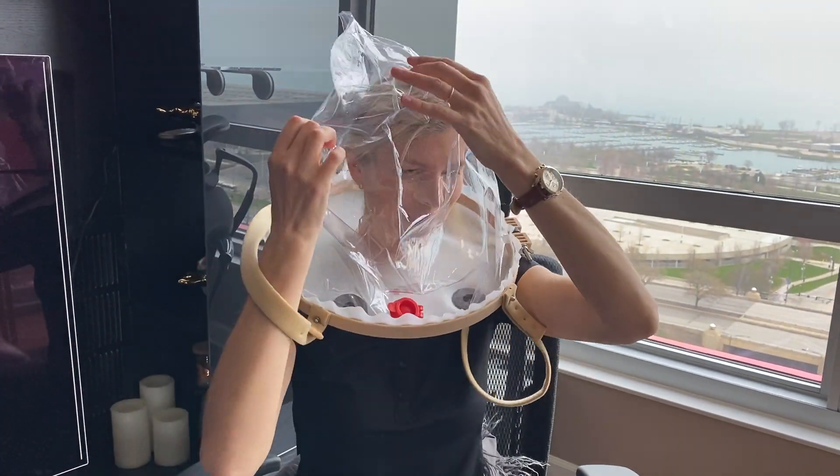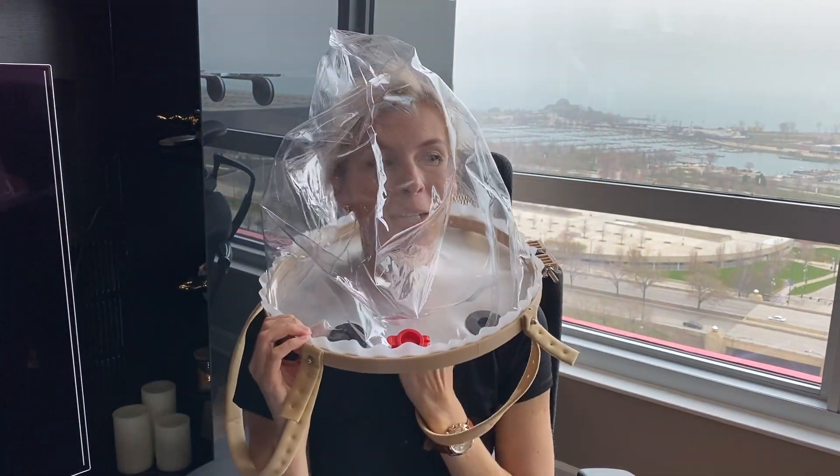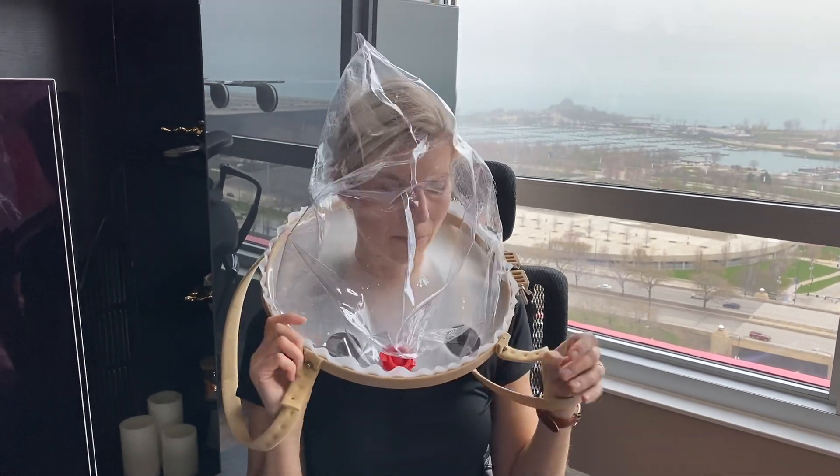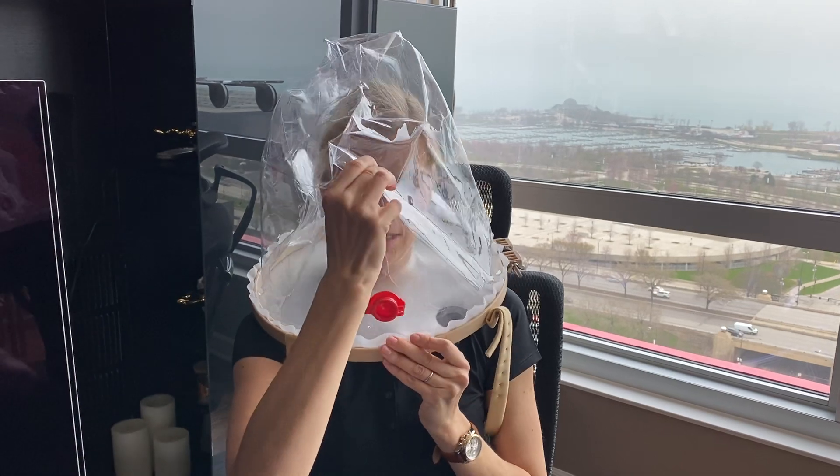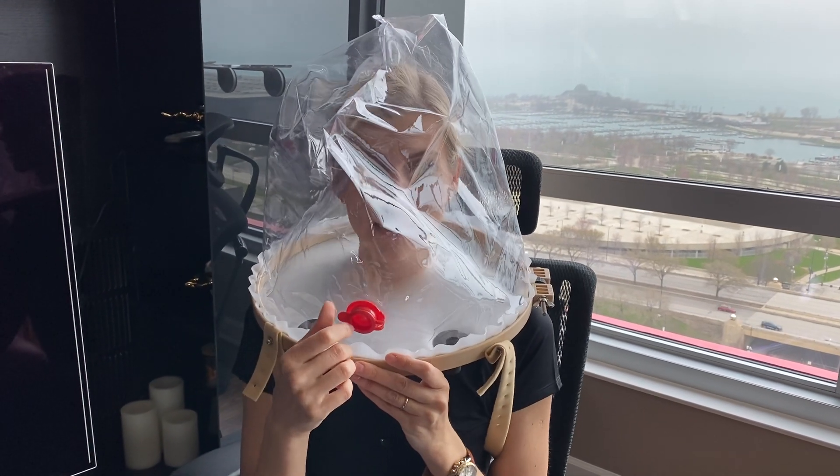Alright, so it's pretty comfortable. It's not too tight around my neck. And here, as you can see, is the patient access port.